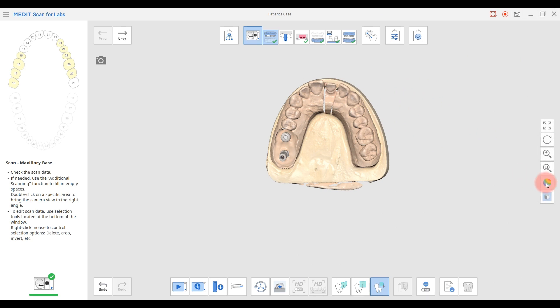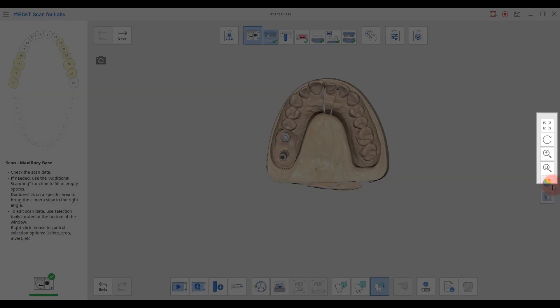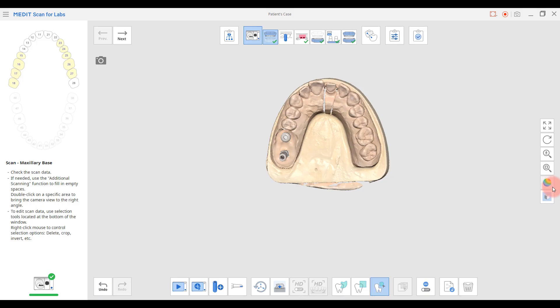There are handling tools on the right side for the scan data. Starting from the top, they are pan, rotate, zoom in and out, zoom fit, model display mode, and grid.